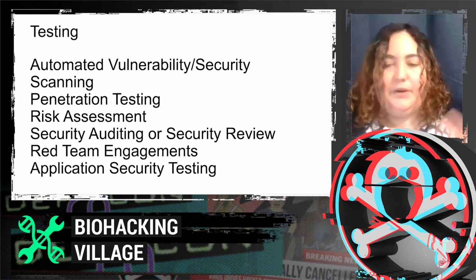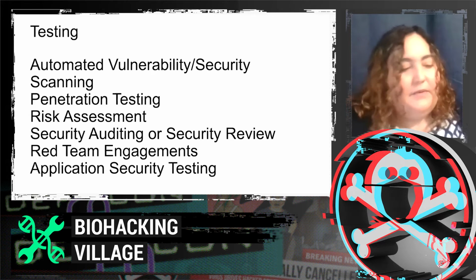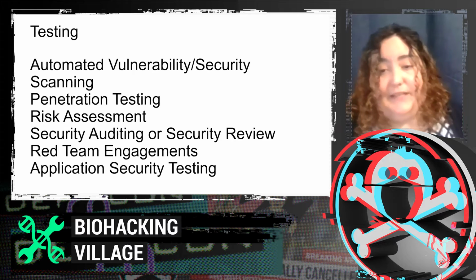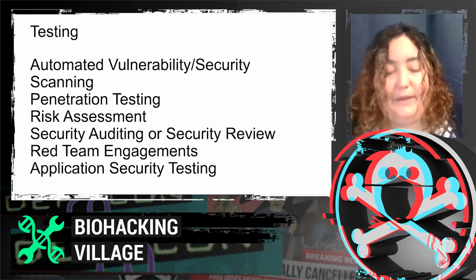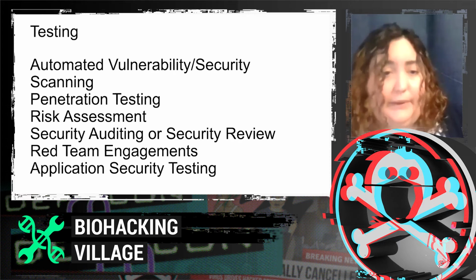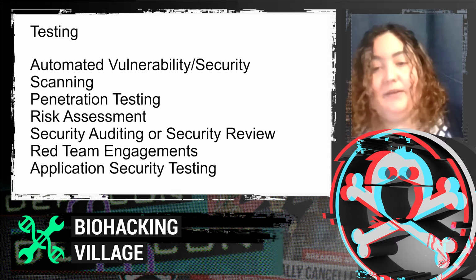So you're going to prioritize components that carry the highest risk, and you'll say, okay, this stores most of our patient data, for example. We're going to mark it for some more robust testing so we can get an idea of where our weaknesses are and really plug those holes to the best of our ability.